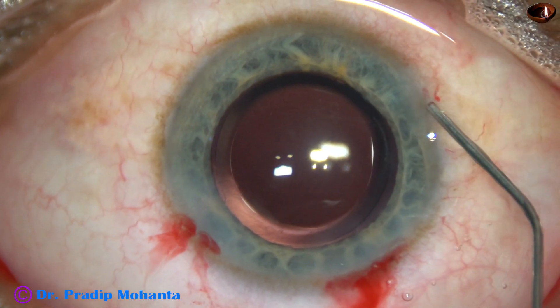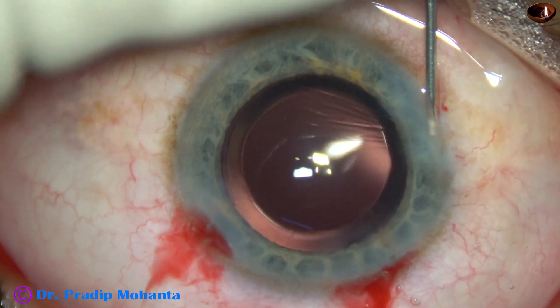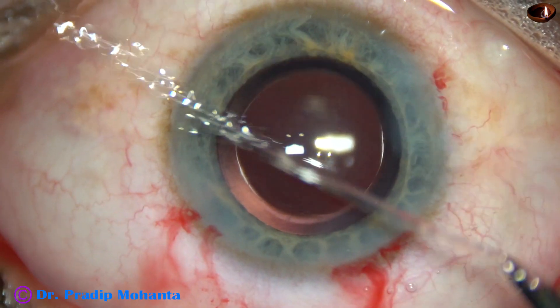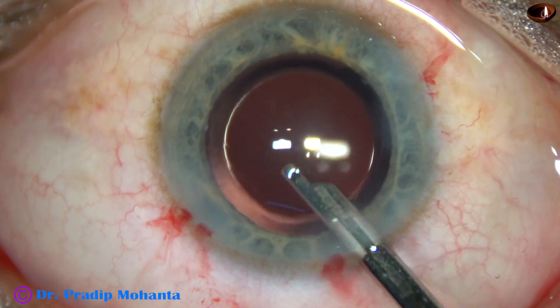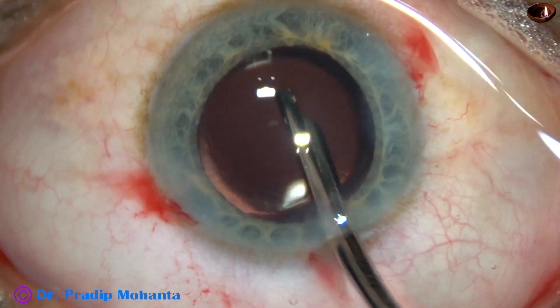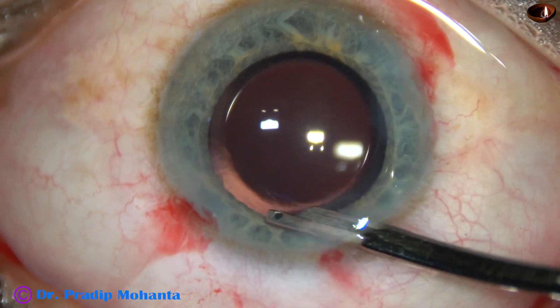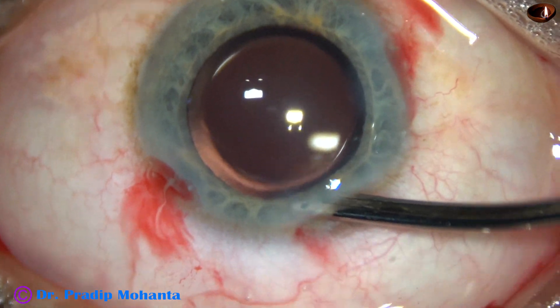The lips of the side port wounds become thick and they get nicely opposed. And now, our final lavage of the anterior chamber. At this time, any visco remaining on the back surface of the cornea is removed. The anterior chamber is nicely washed and nicely formed. And then the case is concluded.